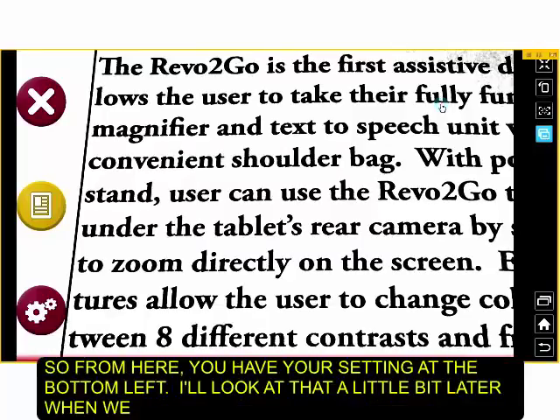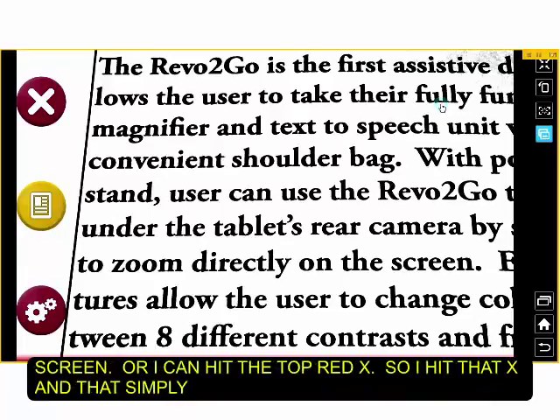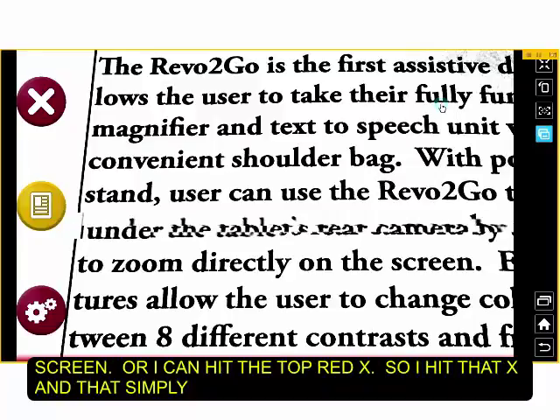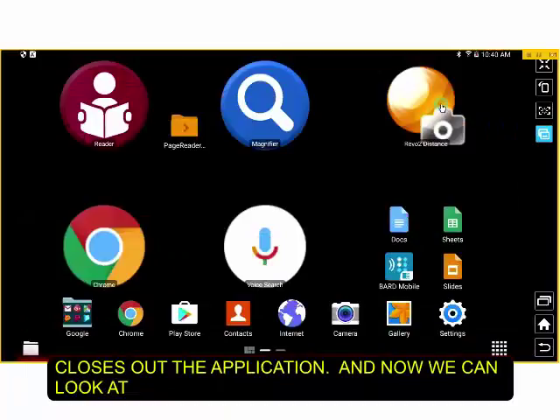So from here, you have your settings at the bottom left. I'll look at that a little bit later when we get over to the Reader app. But in order to close that, I can either hit my Home button on the screen itself, or I can hit the top red X. So I'm going to hit the top red X to close that out. And that just simply closes out the application. And now we can look at what else is on the screen.